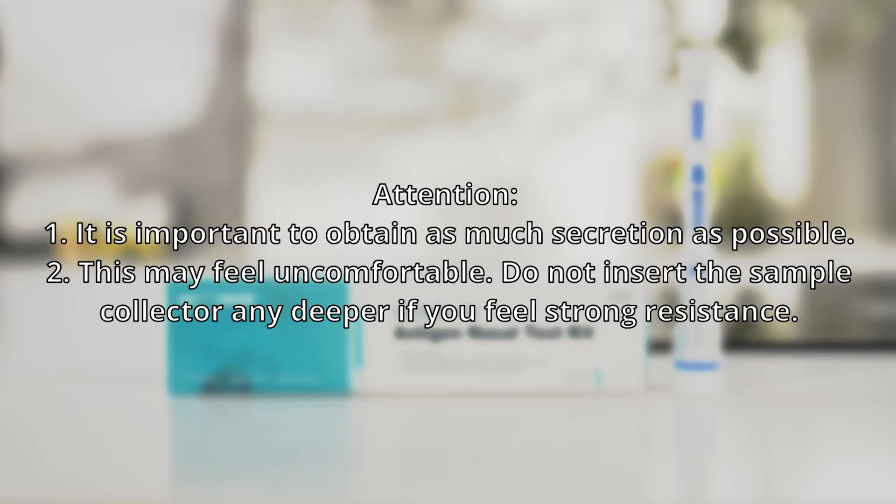Attention. 1. It is important to obtain as much secretion as possible. 2. This may feel uncomfortable. Do not insert the sample collector any deeper if you feel strong resistance.